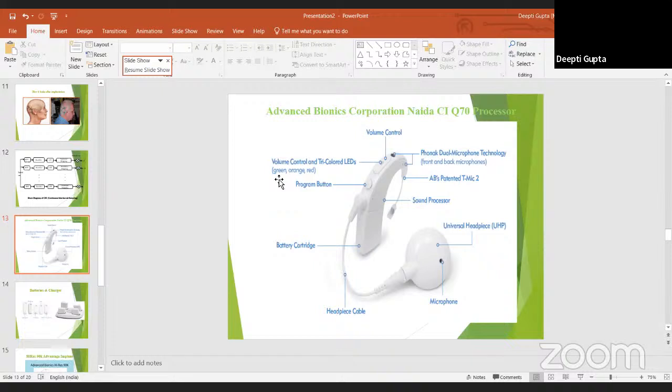And if the green light blinks 4 times, it means it is responding to the AB My Pilot request to find a paired device. What is AB My Pilot? I'll explain it a little bit later. So these are the functions of the tricolor LED.